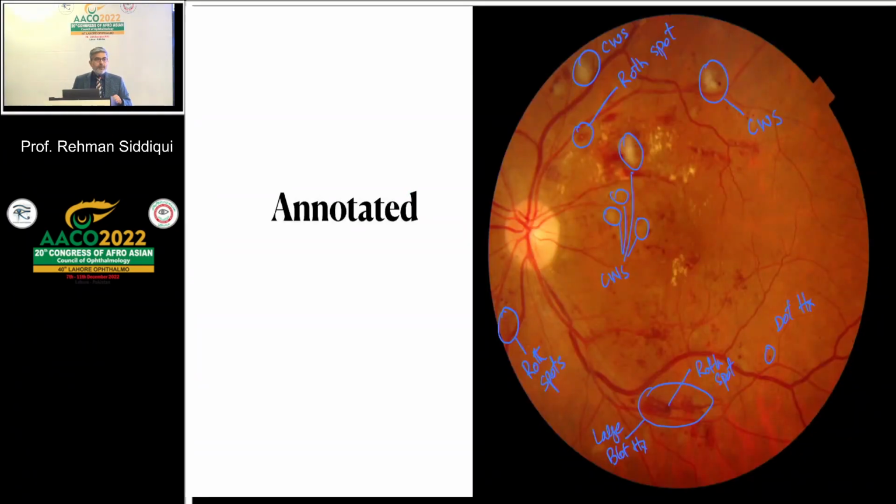This is one of the images that I was annotating. And you can look, where do you stop annotating a single image? It's very time consuming because there are different features, and if you identify one microaneurysm, do you identify the other microaneurysm? What do you do? And this is a labeled image. So I haven't done anything here. I just labeled grade 4 diabetic retinopathy. So then I just go to the next image and the next image.